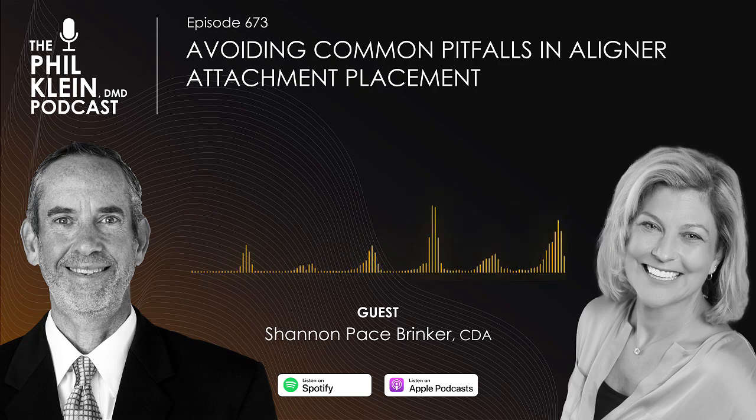Okay, so it's got a power. Absolutely. It's like it's got a turbo mode, and boom, 3 seconds you're done. So you've gone from one tooth to the next. You're isolated with OptraGate, so you've got no moisture on these teeth. You're going from, let's say, one upper molar all the way across the arch to the other molar. You've got numerous attachments that you need to create through this template. So now that you're finished with your bonding, what's your next step?